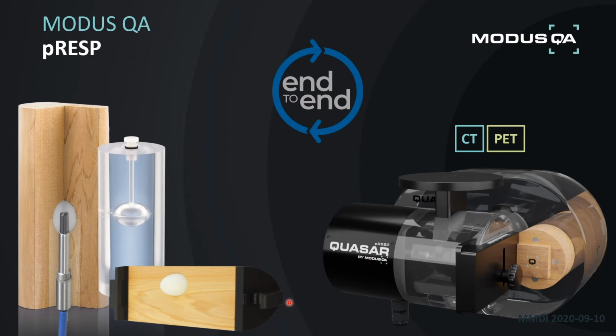dose. And sometimes people ask, why are you choosing these materials that you have here? They may not be water equivalent, etc. The main thing is we have to remember that these are used for physics tests, and you're testing a process, so it is relative dosimetry, and there are correction factors for the materials, and your treatment planning system can make those adjustments as well. So it is a very useful tool, and this Phantom is very popular. A lot of features that people like, and it's simple to use. And I'll highlight some of the other inserts that we have with it on the following slide here.